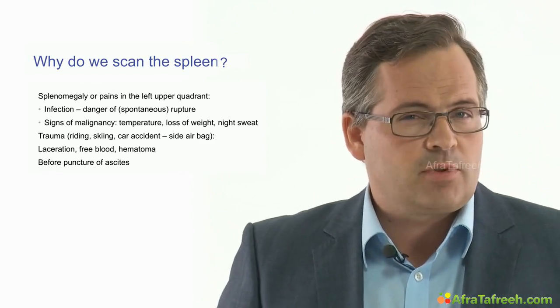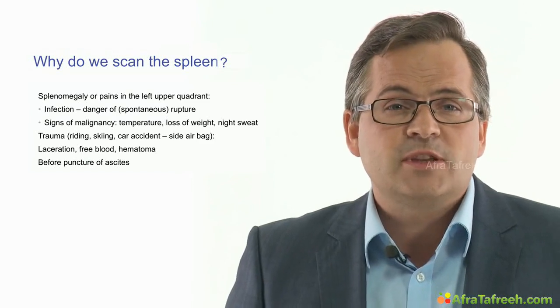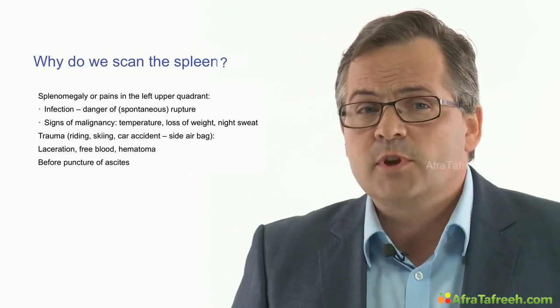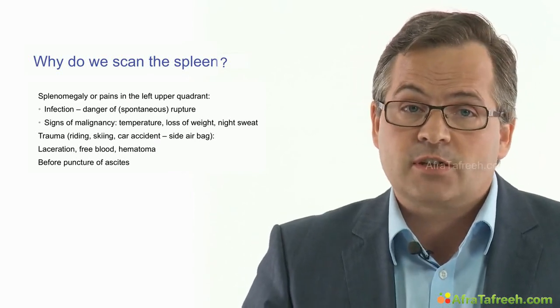But here also the following applies. Skill comes with practice. It is essential that the spleen be depicted in the course of every examination of the abdomen, to measure and to document it. This routine will make it easy for us in a case of emergency to find the spleen and to detect potentially critical conditions. Performing ultrasound on the spleen, we can detect an enlarged organ, we can identify lesions, and in the case of an injury, sonography is the best technique to find signs of an acute bleeding and laceration.